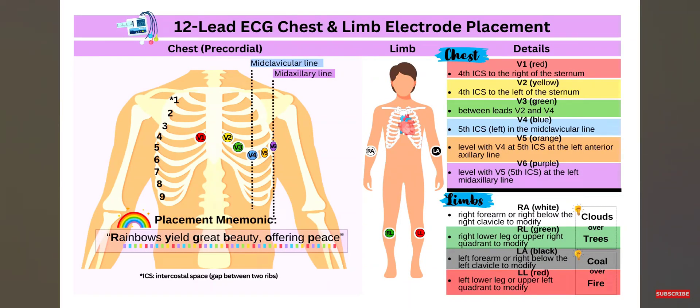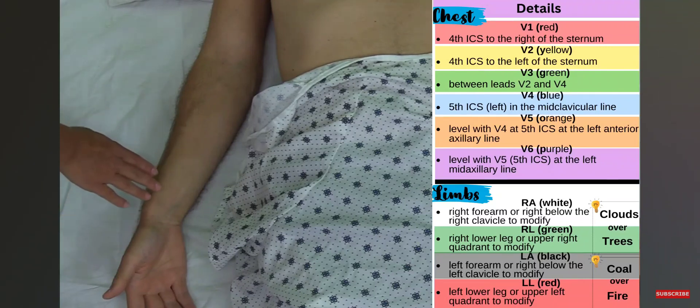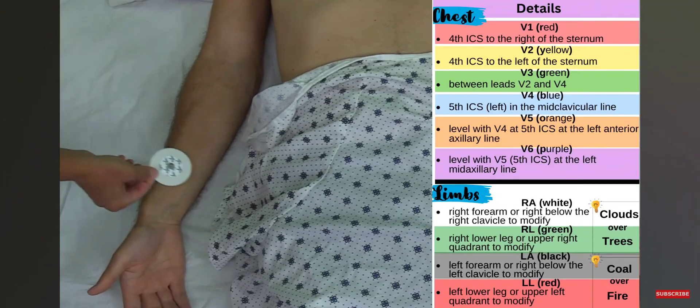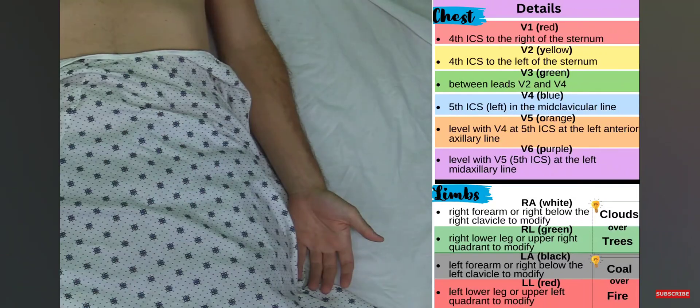You'll want to perform this for all the sites where you place the electrodes. I've prepped all the sites and I'm going to place the limb electrodes first — right arm, left arm, right leg, and left leg. Beginning with the right arm, I want to go just above the wrist in the forearm area. I'll take the electrode, pull the backing off, place it right here, and push it down so it sticks firmly.